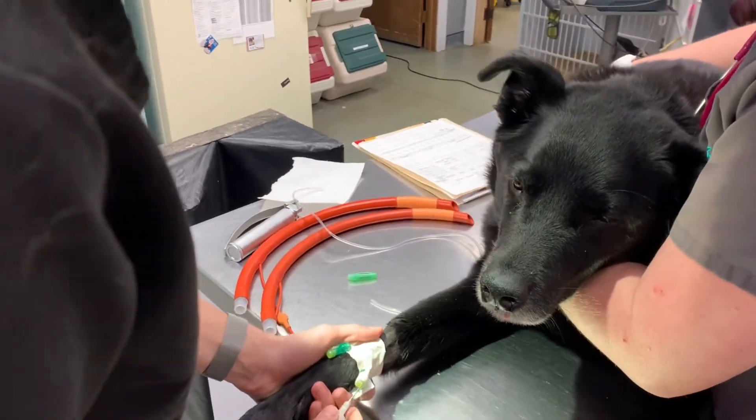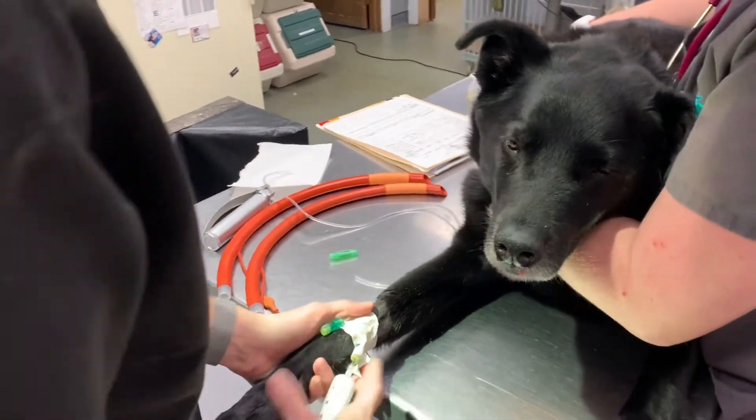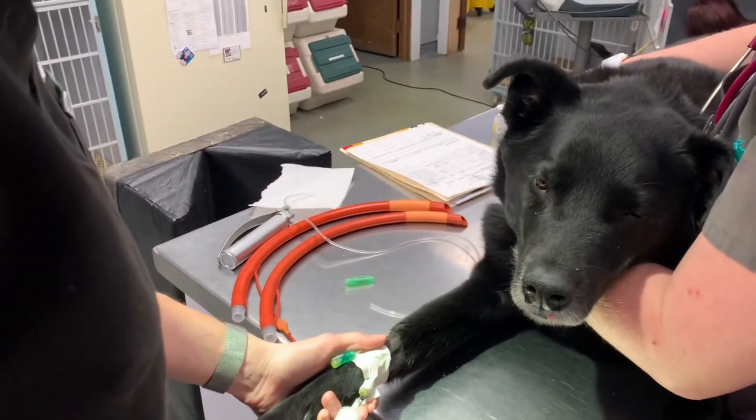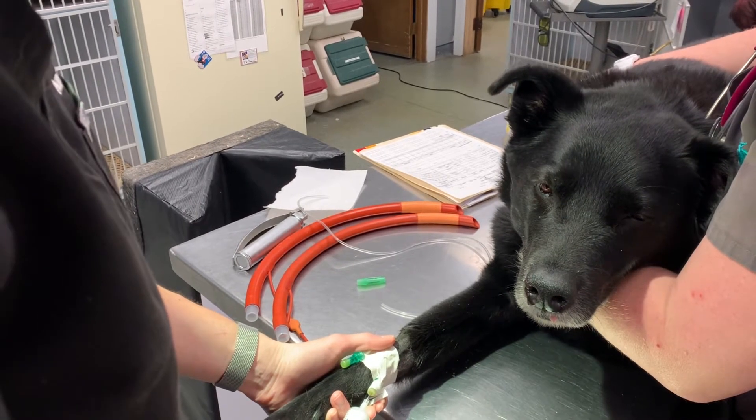We're intubating this dog for surgery, but this is going to be very much the same as what we would do in the field if we need to intubate one of the canine officers.